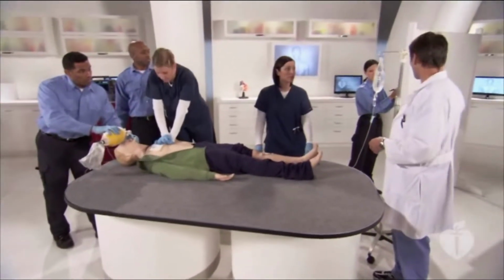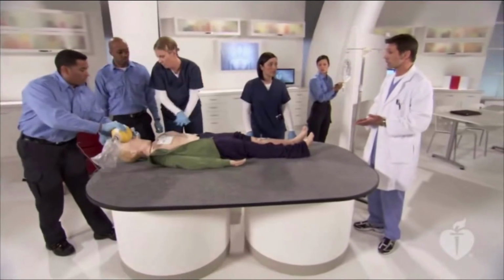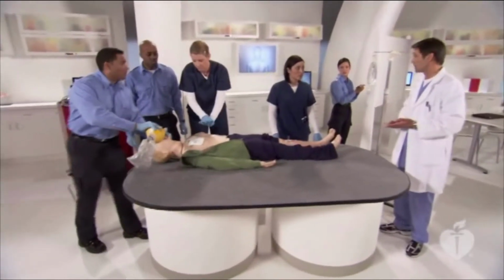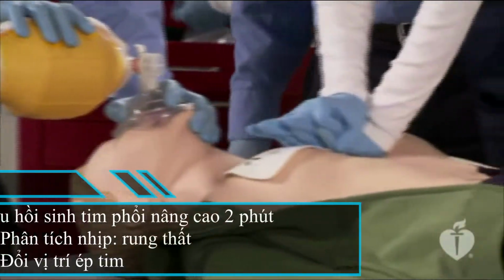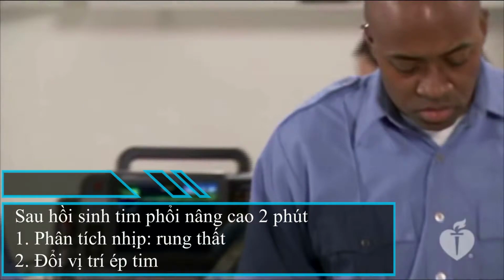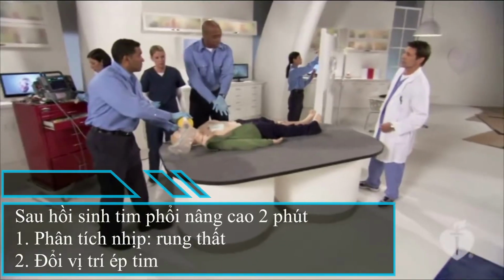Shelley, I'll rely on you to monitor the quality of the chest compressions. Dana, you'll need to draw the drugs up before each rhythm check, so if the arrest persists, we can move quickly to drug therapy. Let's begin with 1 milligram of epinephrine. Trying 1 milligram epinephrine. 2 minutes. Okay, let's analyze. Switch roles. Okay, the patient remains in VFib.